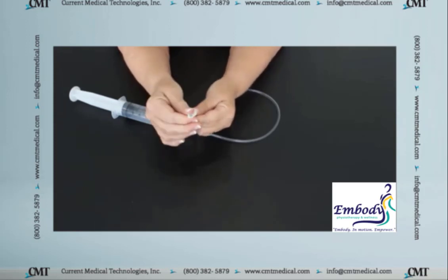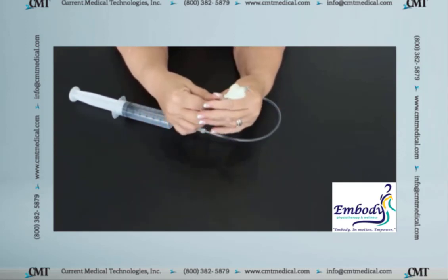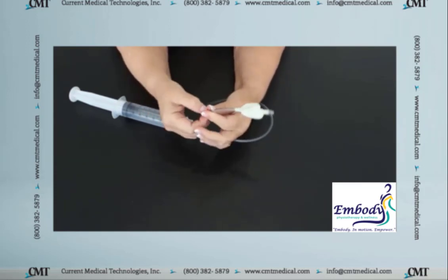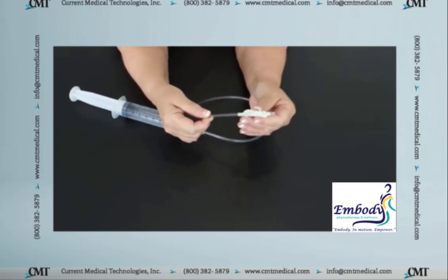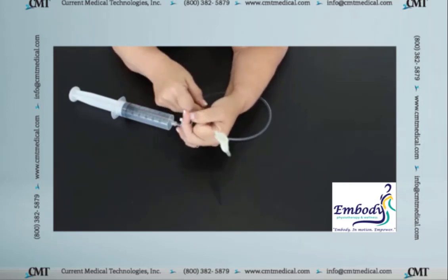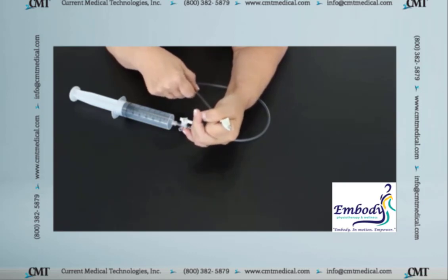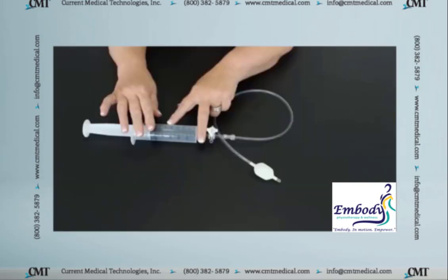Once you have it in this position, slide the condom down over the whole balloon as well as the tube. You're going to be inserting the balloon into the rectum through the anal canal to the edge of the condom, so just a little bit of the ring of the condom is going to be sticking out of the external anal sphincter when you get through inserting it. Remember, we want the balloon up above the muscle shelf so that the sensory piece picking up are the pressure receptors of the rectum and not down in the anal canal. We'll be working the anal canal a little bit later when we talk about training the opening and the wave peristalsis effect of the internal and external sphincter.